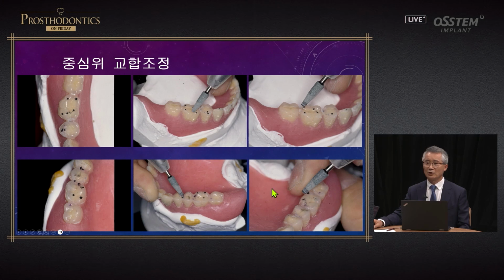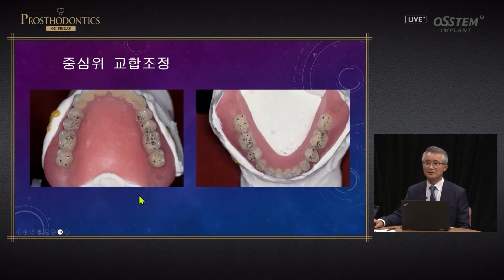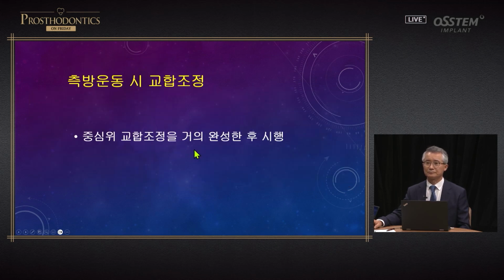When marking is significant, excuse me, if you find some markings significant, you can remove a bevel and make a cusp tip smaller. You need to make adjustments accordingly. There are big dots, small dots. I think this is sufficient from number 7 to 4. There are consistent markings, so it's okay.